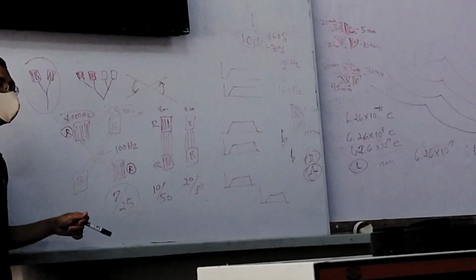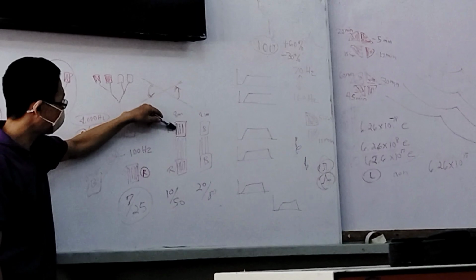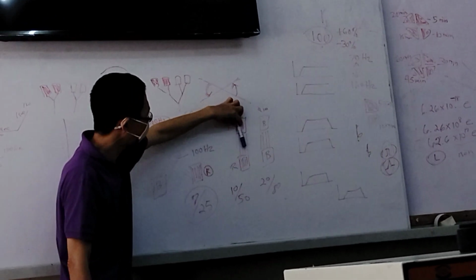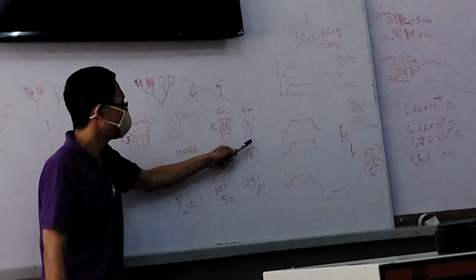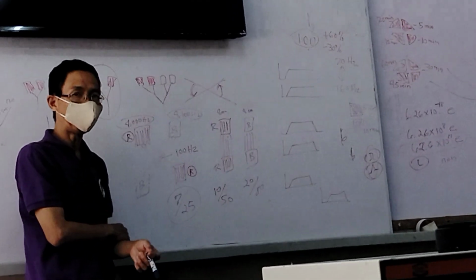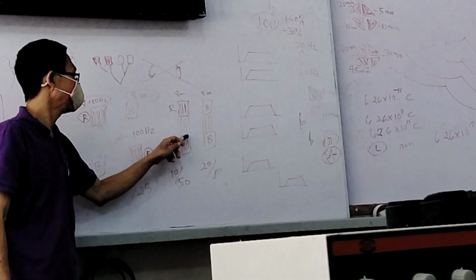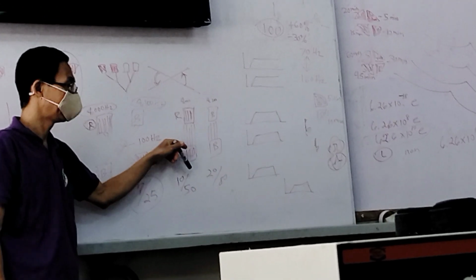So you should not position your electrodes this way, red with red, black with black. Once you turn on the machine, you would not expect the current to go from red to black. Although the patient can still feel the current, the problem is that there is no intersection or interference of the currents.